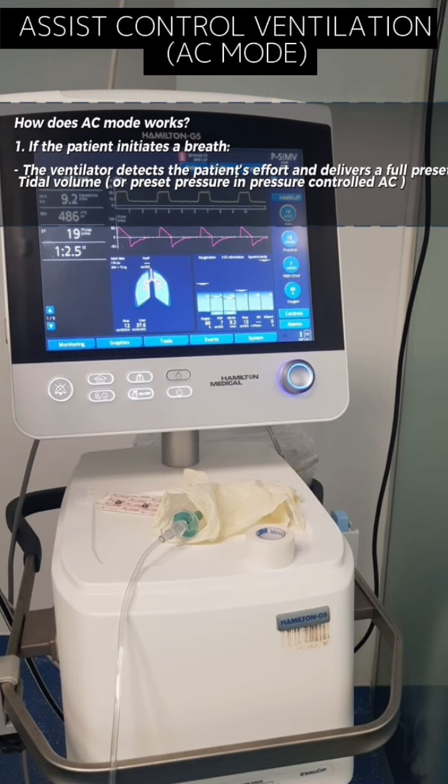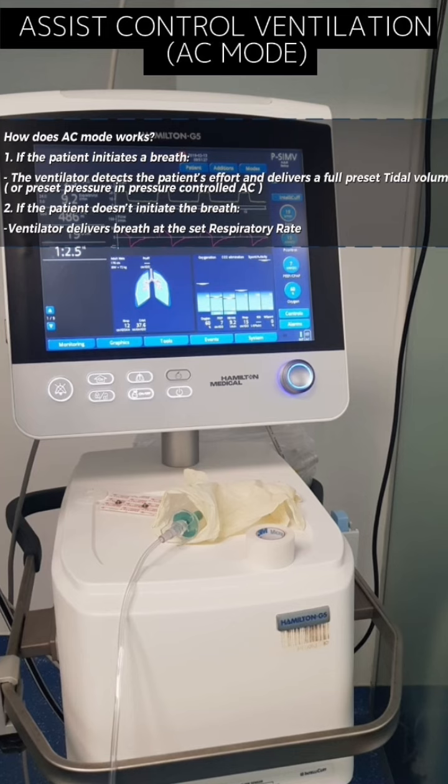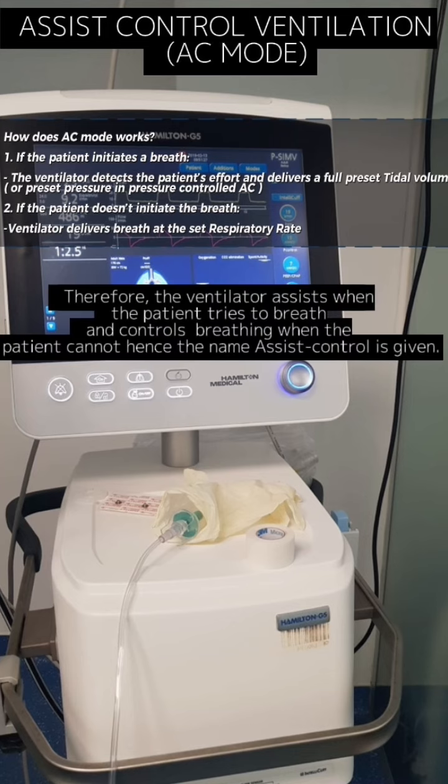If the patient initiates a breath, the ventilator detects the patient's effort and delivers a full preset tidal volume, or preset pressure in pressure controlled AC. Even a small patient effort results in a full ventilator breath. If the patient does not initiate a breath, the ventilator delivers breaths at the set respiratory rate. Therefore, the ventilator assists when the patient tries to breathe and controls breathing when the patient cannot. Hence, the name assist control.